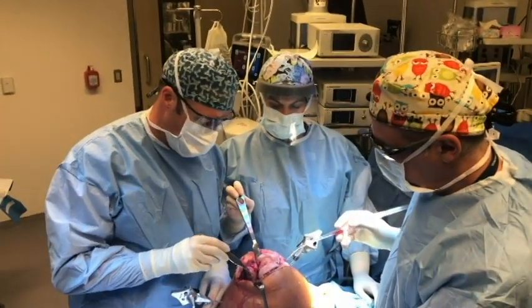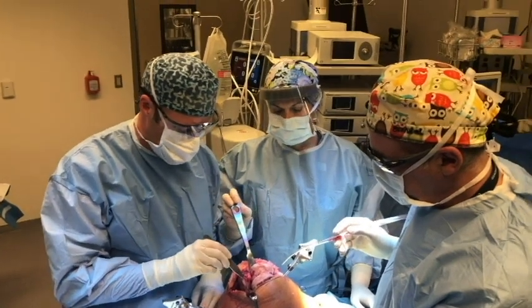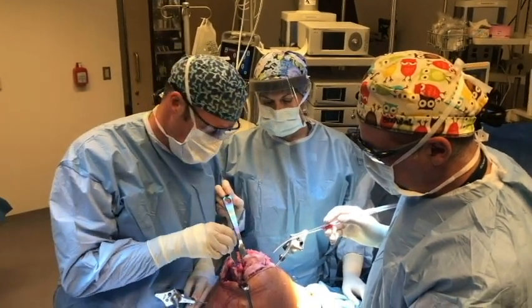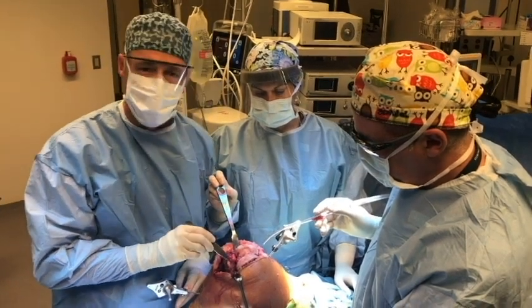You can see we just got into the knee joint, and on the medial — or the inside — that's where the large defect exists. Typically the tibial plateau would live up about here, but if you see where my forceps are going all the way down, it's much more than a centimeter deep. That'll be one of the challenges of this case.